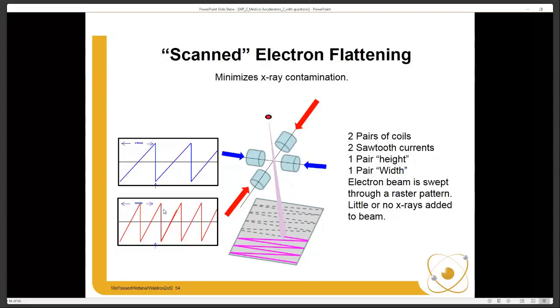We have to provide them. They have to be accurate. The downside is if this fails, this is an extremely high fluence electron beam, because the fluence of this beam has to give us our desired dose rate spread out over a 40 by 40 field. So that now means that the instantaneous dose rate of this 1 centimeter wide beam is going to be several thousand MU per minute or centigray per minute. And so the complication and the risk sort of negate the benefit in many cases. I don't know that any manufacturers are using this for medical electron Linacs.